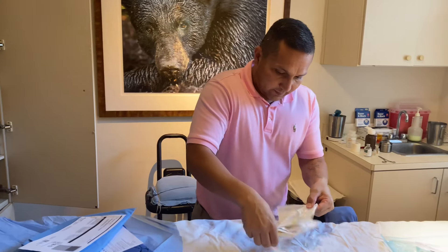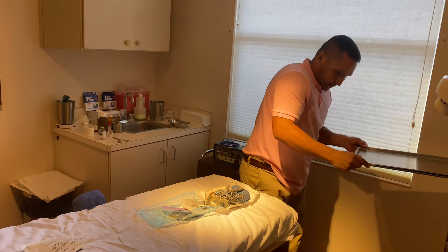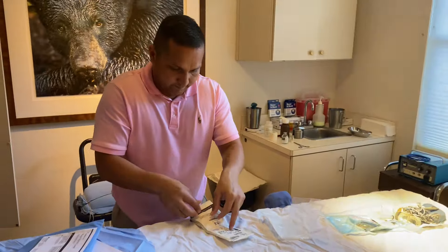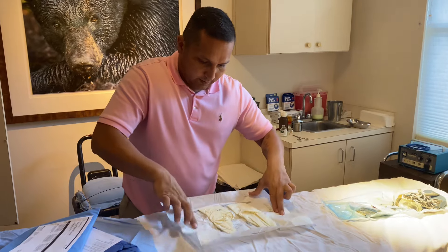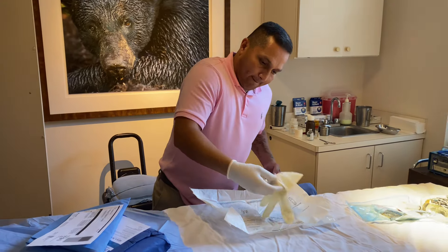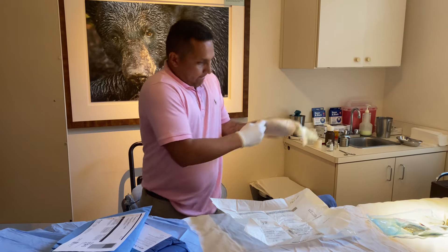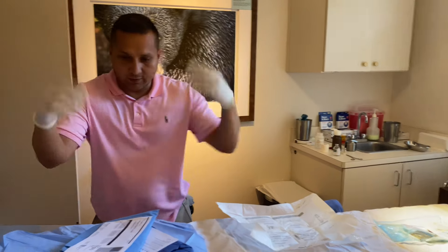Everything is still sterile. I'm just going to pull this up to me just a little bit, put this aside, and glove up. The first time I ever did this was kind of difficult.